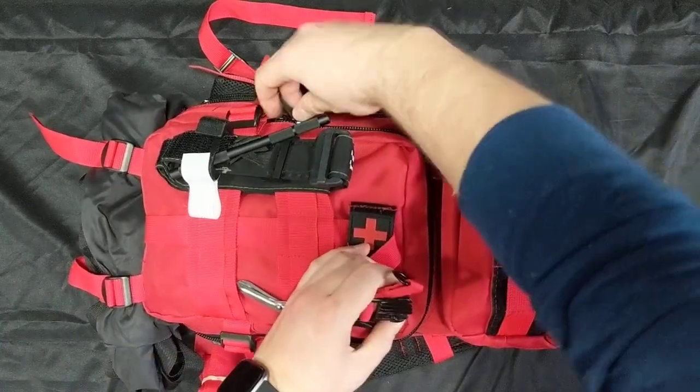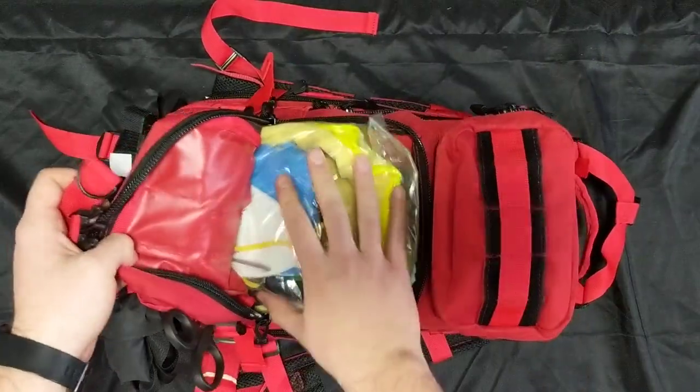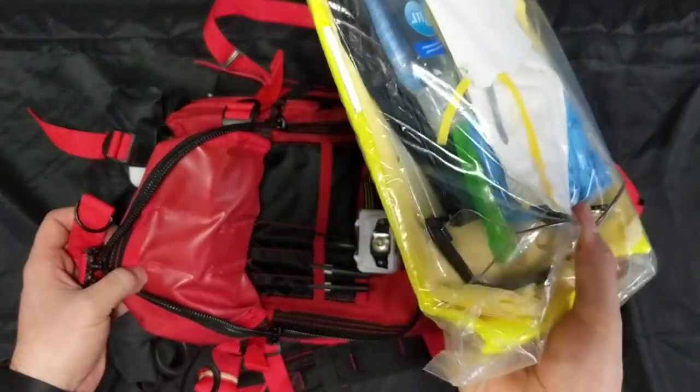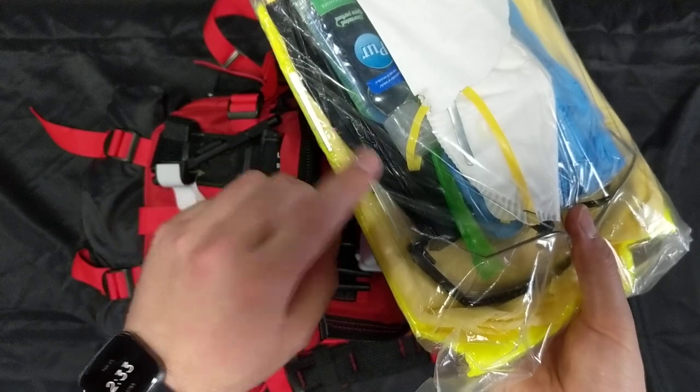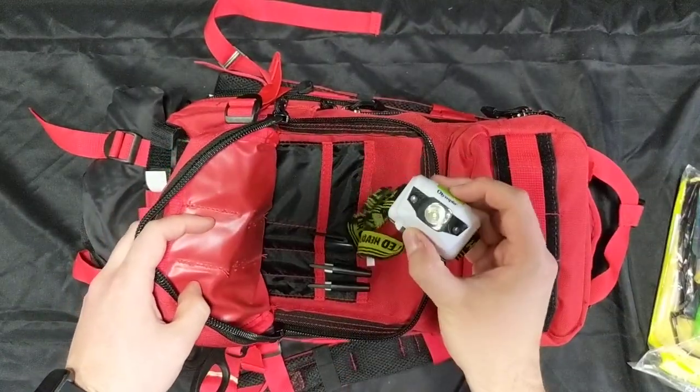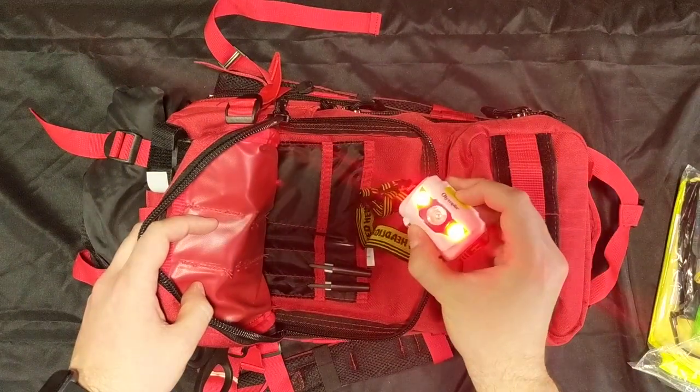Your first pouch has a full set of PPE including a high-vis vest, isolation gown, mask, gloves, hand sanitizer, emesis bags, garbage bag, goggles, and a nice headlamp with both a white light and a red light.